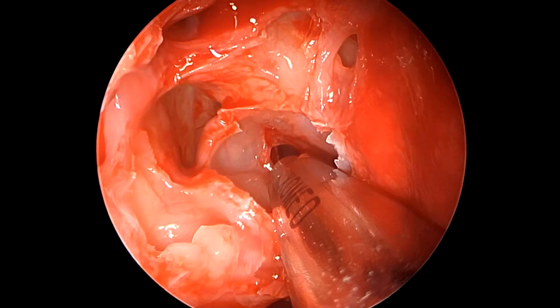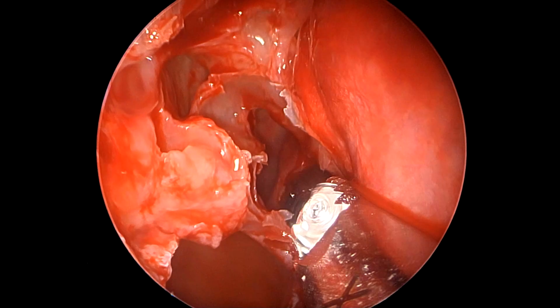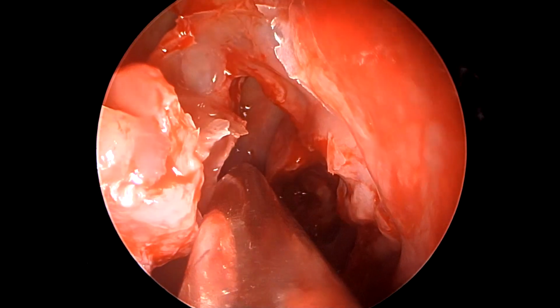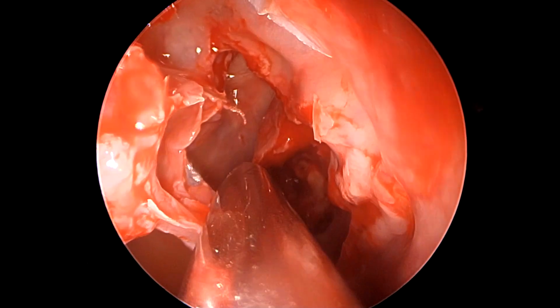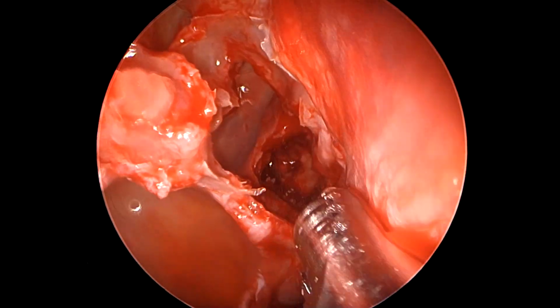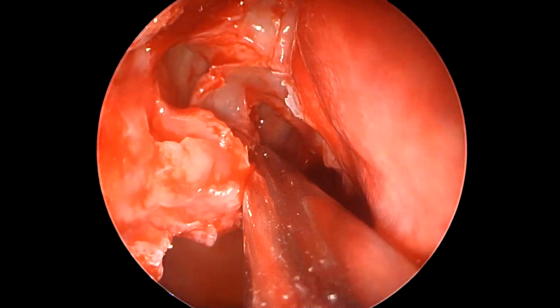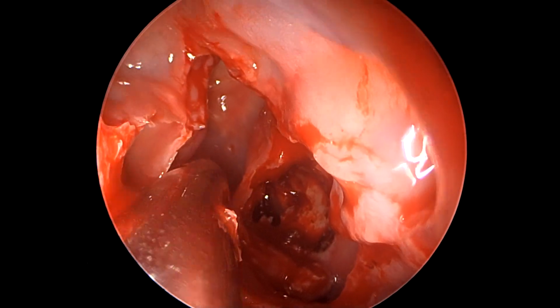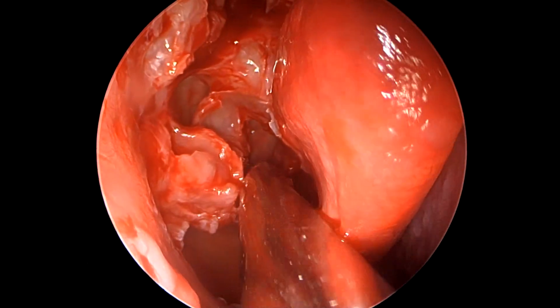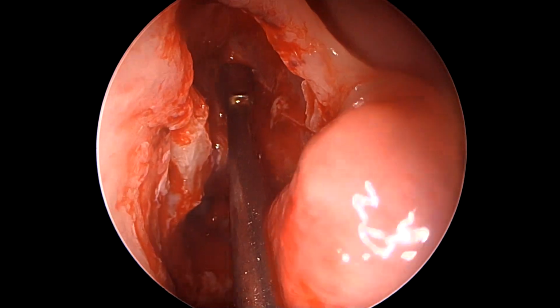As we see here, we have removed some bit of the posterior ethmoidal septations. The sphenoid was already open, and now we can see our entry inside the posterior ethmoidectomy cavity. We are just taking the microdebrider blade to slightly widen it. The posterior wall of the maxilla is clearly visible here. So as you see, we have widened our access in the posterior ethmoidectomy cavity nicely.